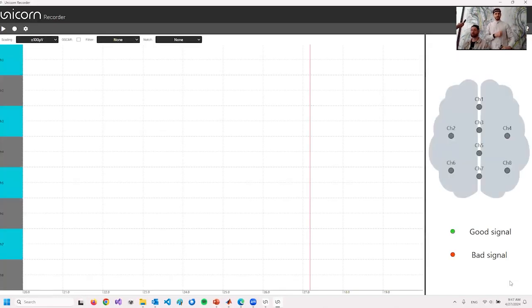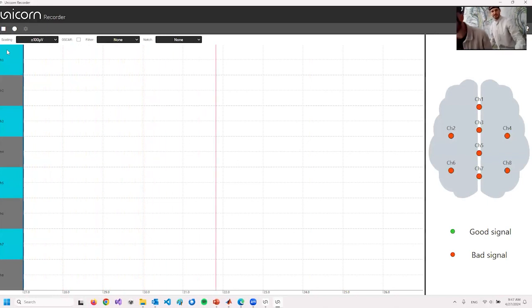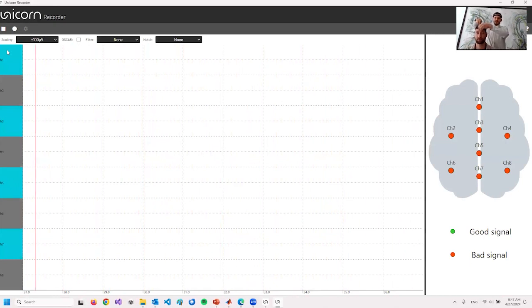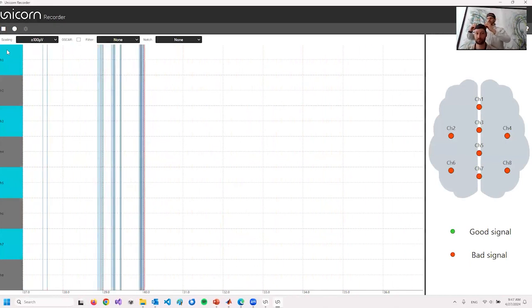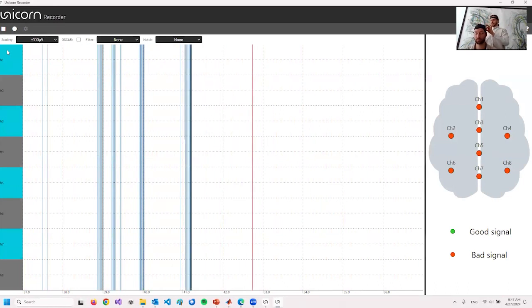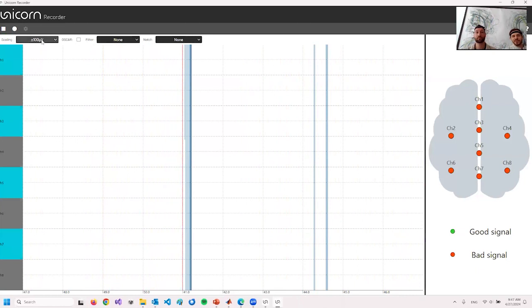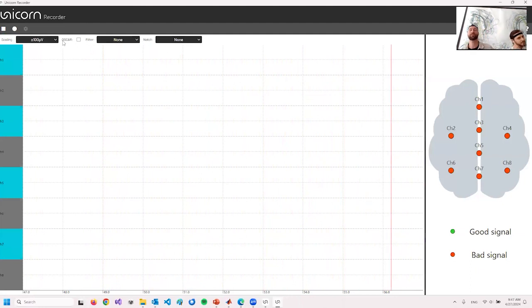Recording stop. Maybe you can get a little closer to the PC. So right now we don't see much at all because we didn't apply any filters yet. And that's why we need some pre-processing filters. So as mentioned before, most of the EEG signal is within plus minus 20 microvolts. And to measure the signals properly, we need to apply some filters.